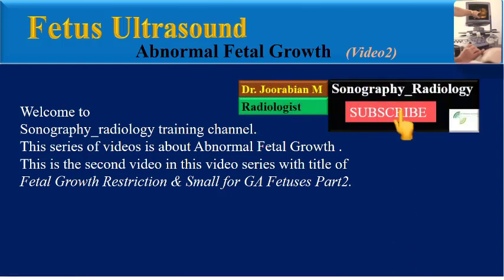This series of videos is about abnormal fetal growth. This is the second video in this series, titled Fetal Growth Restriction and Small for Gestational Age Fetuses, Part 2.